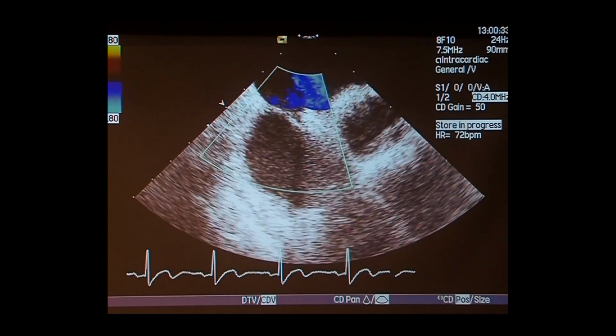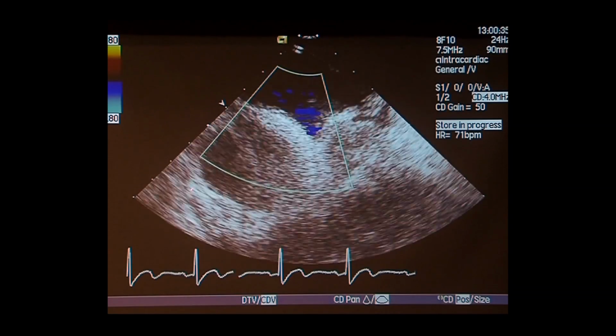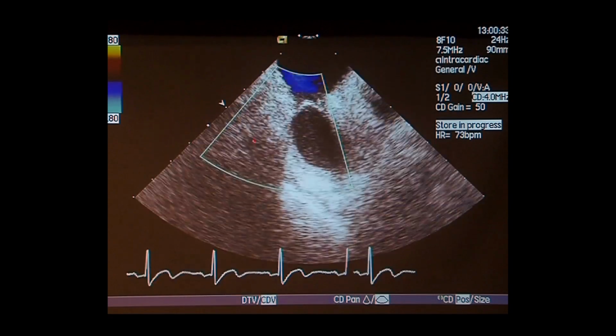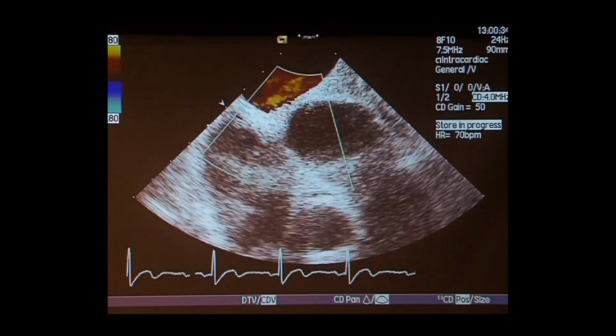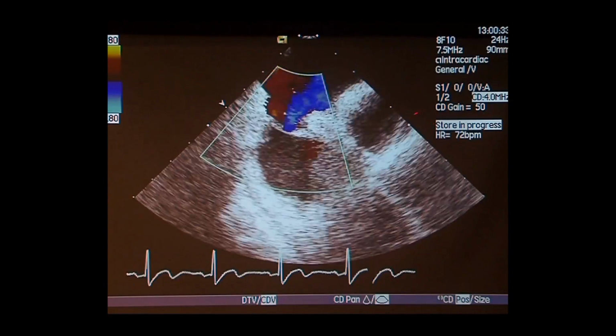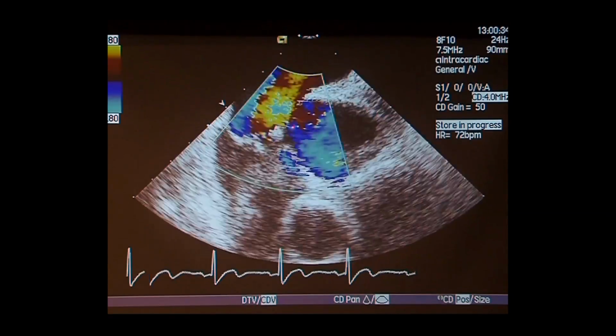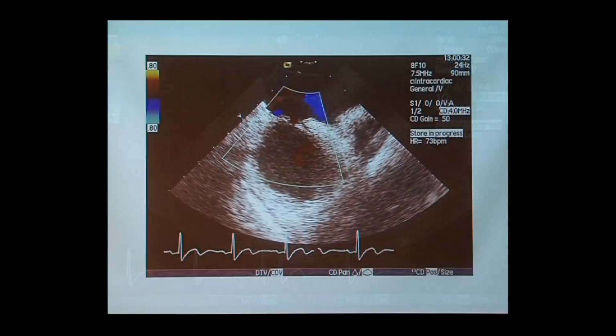So this is what is called an intracardiac echo probe, which I have put in through a groin vein up into the heart, and you can see the heart chambers. This is the left atrium, which is the left side collecting chamber. That is the right atrium, which is the right side collecting chamber. You can see the aortic valve, and that is what we call the interatrial septum. And if I can pause it at the right moment, there is a tiny little hole there. You can see the color flow going across through it, and I'll show you how we're going to close this. See that little gap there?